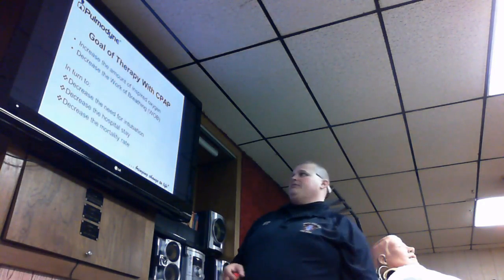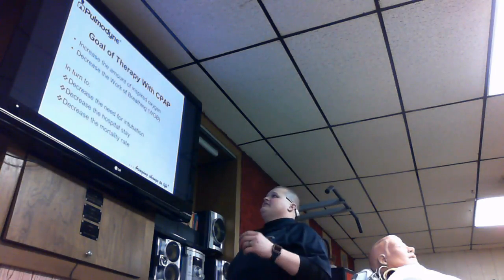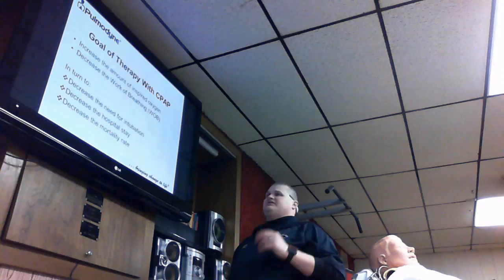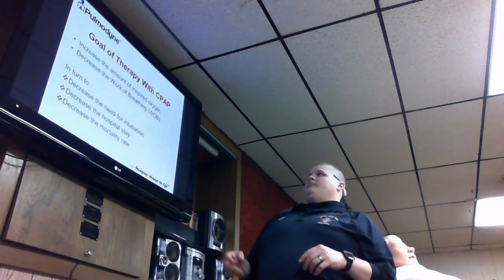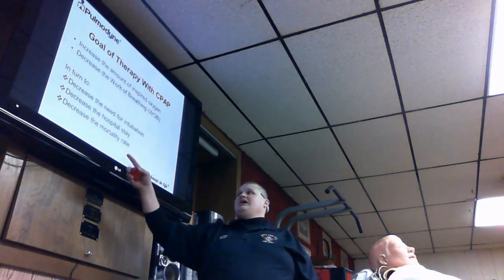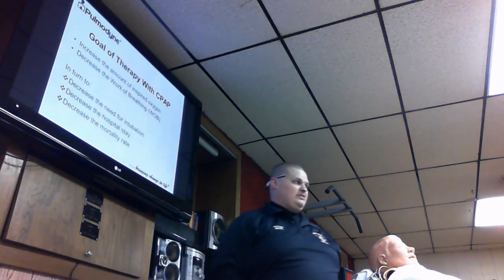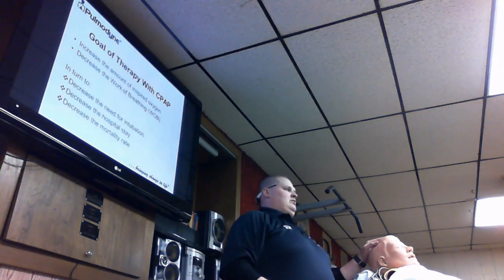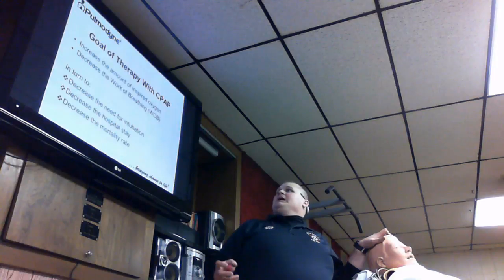So the goal of therapy with CPAP is to increase the amount of inspired oxygen. It's going to decrease the work of breathing, and in turn decrease the need for intubation. It's going to decrease your hospital stay, and it's also going to decrease the mortality rate. So Captain Lance here will be able to survive when he gets into the hospital, and that way I don't have to intubate Captain Lance as well. Okay.